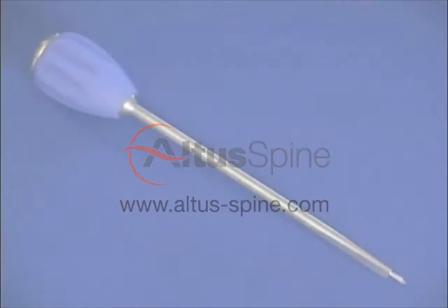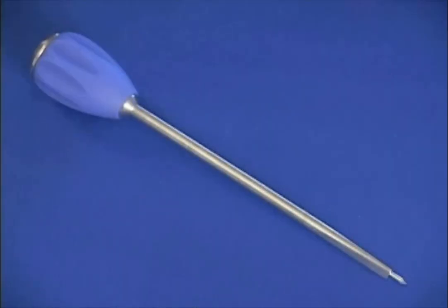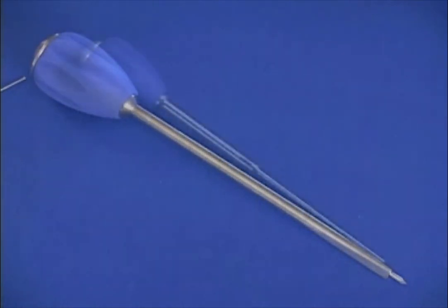The pedicle awl is utilized to break through the cortex of the pedicle during preparation. The awl has a stop to allow for a maximum insertion depth of 20 millimeters, and the distal portion of the instrument shaft is triangulated to accommodate visualization of the tip. The proximal portion of the awl has an impactor cap to accommodate technique.